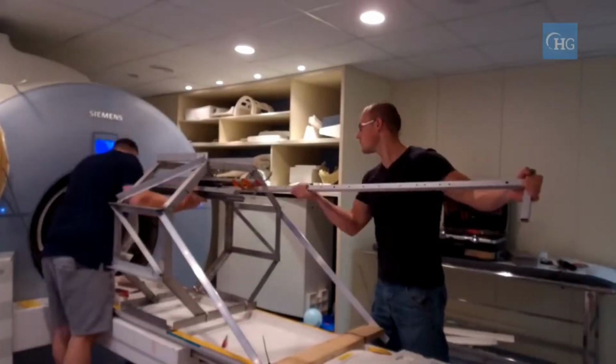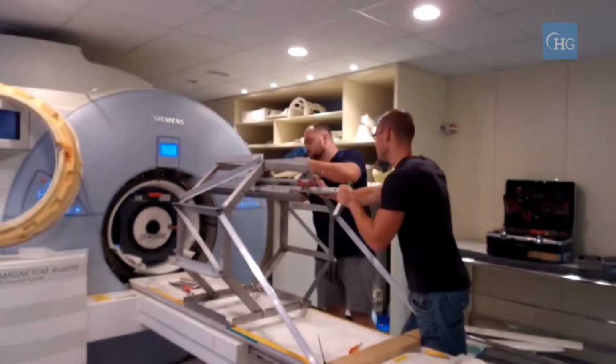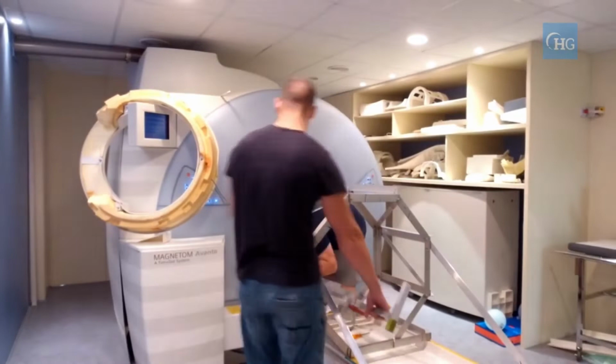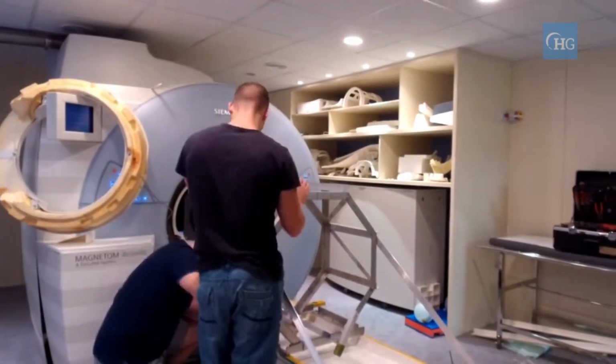To restore field homogeneity, a set of shim coils is included in the scanner. These are resistive coils, usually at room temperature, capable of producing field corrections distributed as several orders of harmonics. After placing the sample in the scanner, the field is shimmed by adjusting currents in the shim coils.